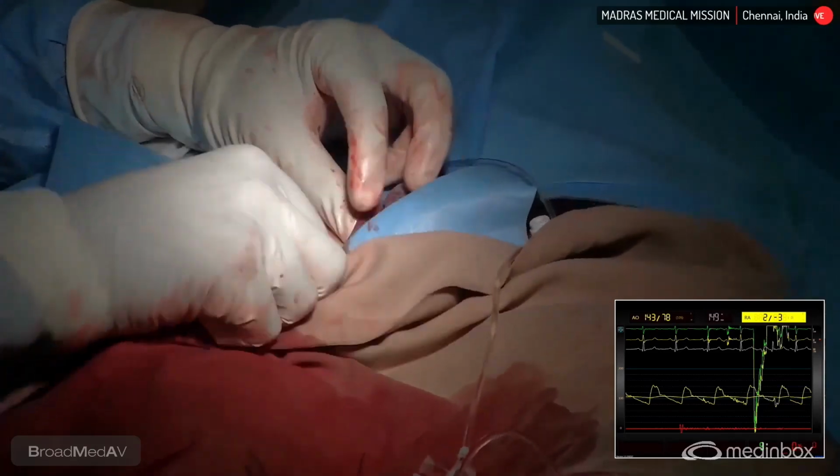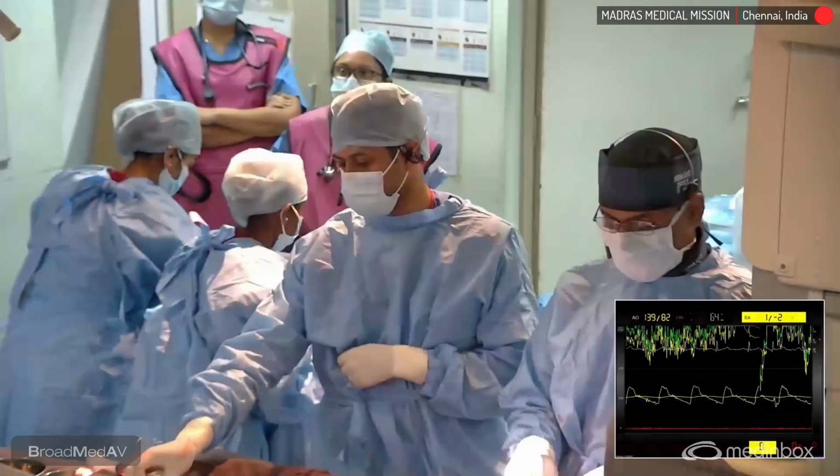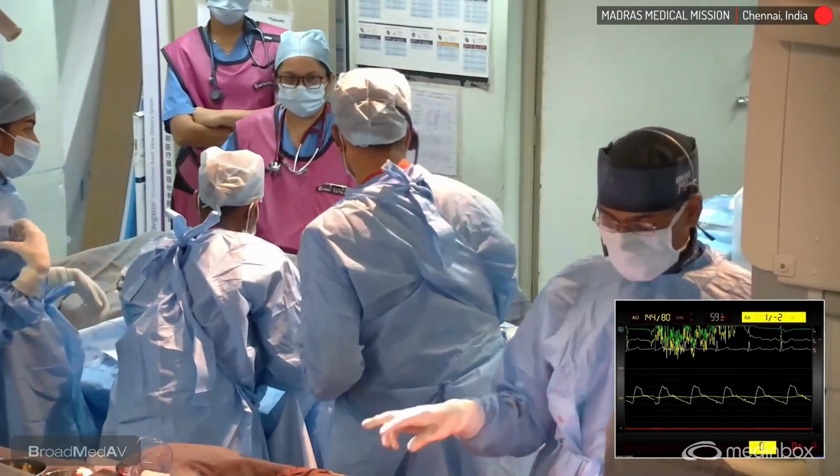So the groin looks clean, not much of bleeding. Let's give some bupivacaine injection topical so that there is not much of pain.